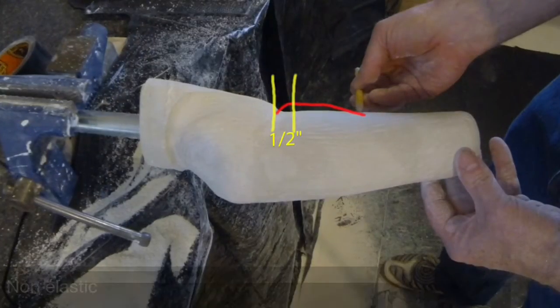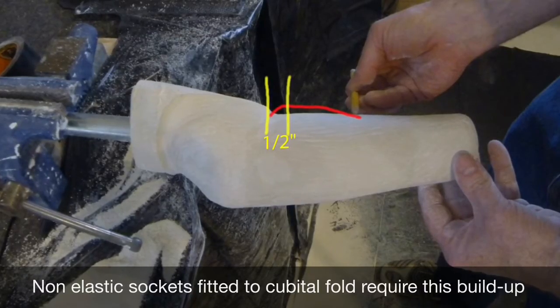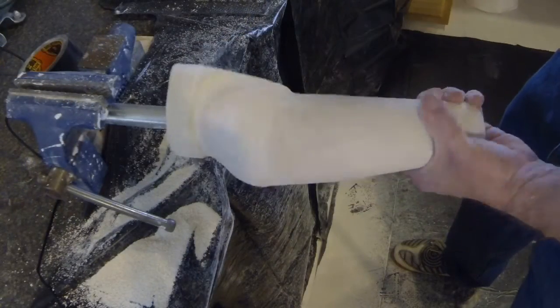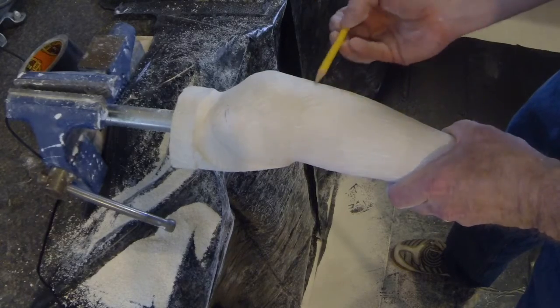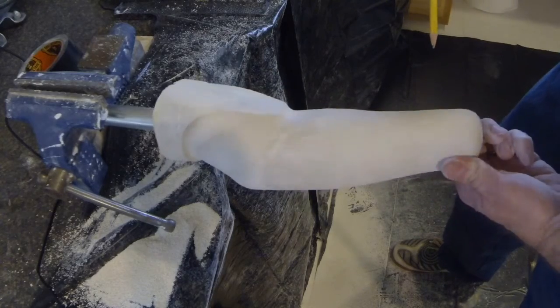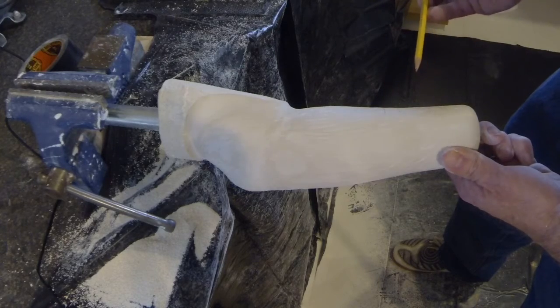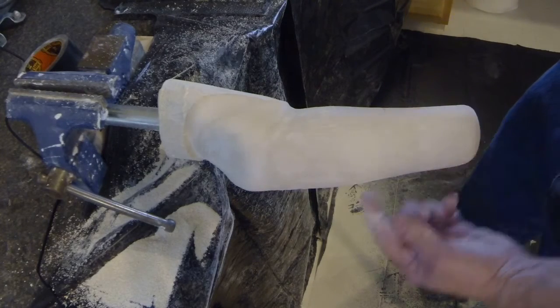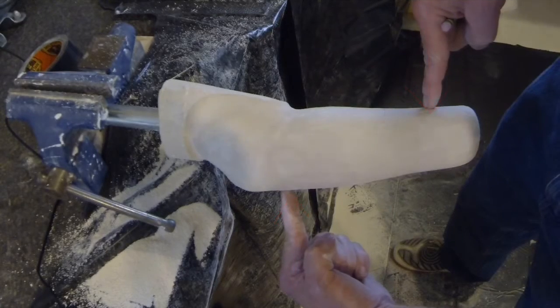If this socket is not going to be fabricated using rolled silicone, plaster needs to be added on the anterior surface as shown. Silicone sockets do not need this modification due to the elasticity of the material. If this buildup is needed, the apex should be ½ inch distal to the antecubital fold and ¼ inch thick at this point. Care should be taken to remove slightly more plaster to avoid any loss of motion, anterior-distal and posterior-proximal.